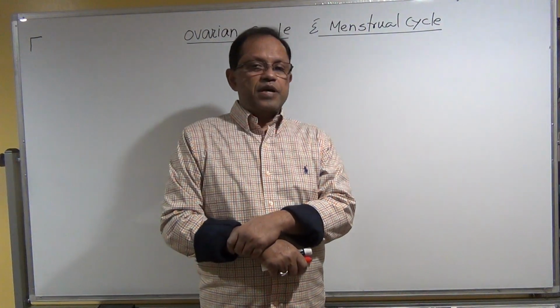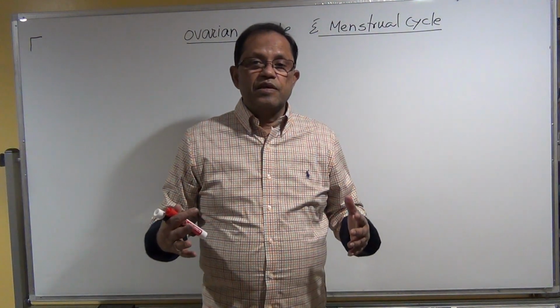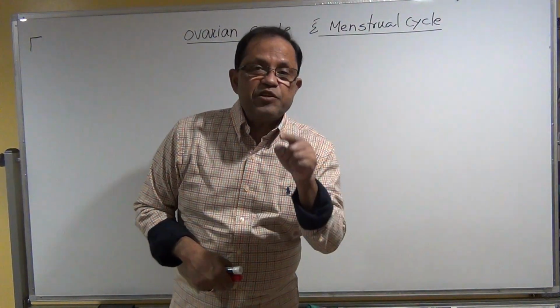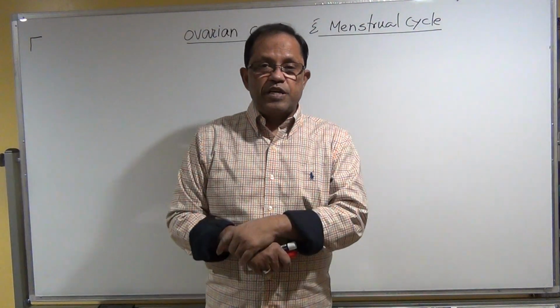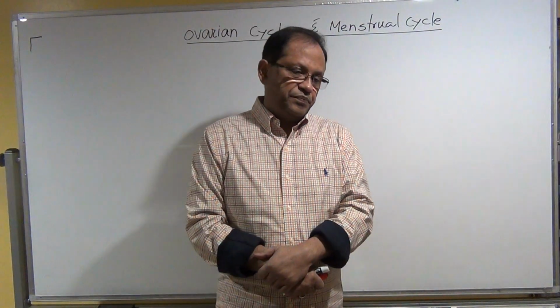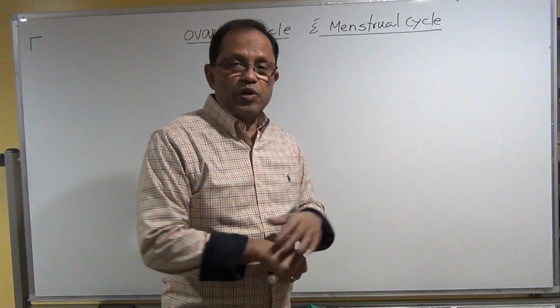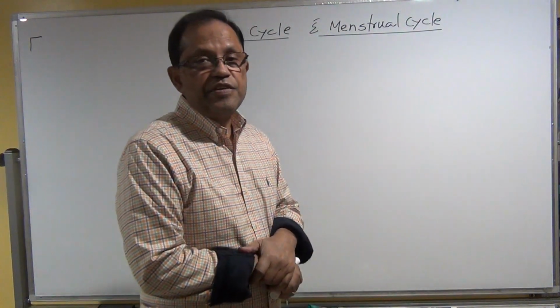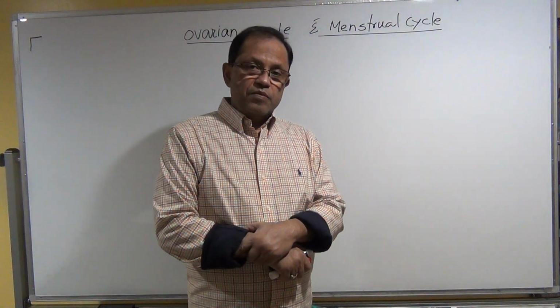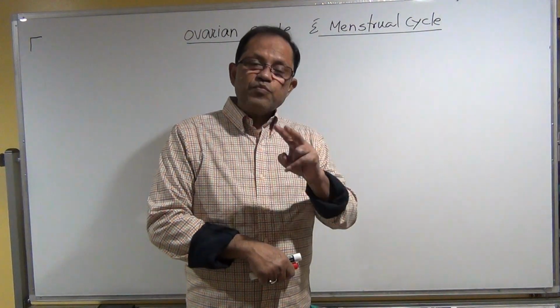Yes, we need to care because there are some changes that happen with the phases of the cycles, and I want to see those changes in ultrasonography in order to understand the cycles are normal, in order to understand that the organs are working normally. That's why we call it physiology. It is discussed in the physiology: functions of the ovary, functions of the uterus.